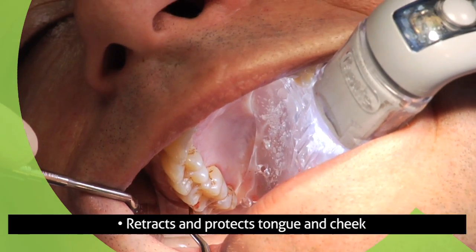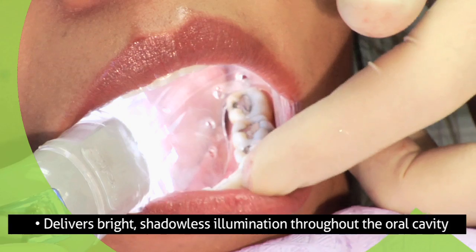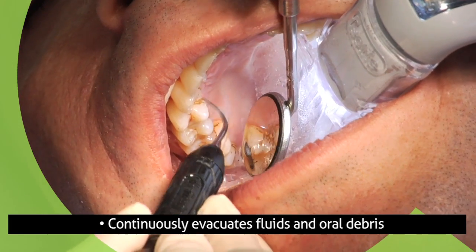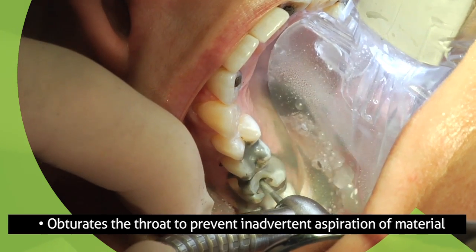It retracts and protects the tongue and cheek, delivers bright shadowless illumination throughout the oral cavity, continuously evacuates fluids and oral debris, and obturates the throat to prevent inadvertent aspiration of material.